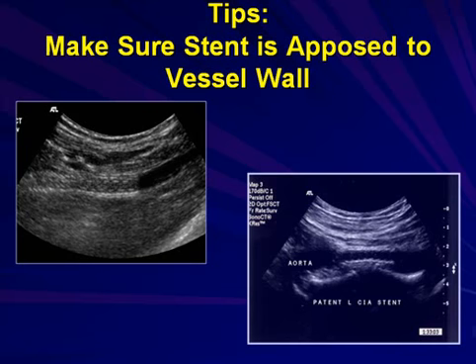Most stents in the United States are nitinol, and most stents in Europe currently today are stainless steel. Even though most stents that we see are nitinol, depending on the manufacturer and how the stents are put together, they do image quite differently. You can see that these two have a very different imaging profile, but they're generally pretty easy to see, and if you rotate your hand back and forth, you can see where they begin and end, because those endpoints are important.